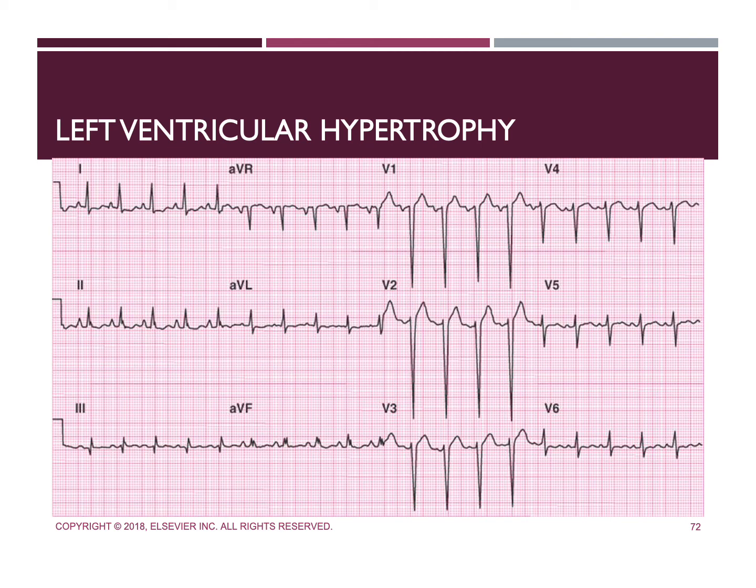To use this formula, we add the S wave amplitude in lead V3 and the R wave amplitude in lead aVL. A total greater than 20 millimeters or 2 mV in women, and 28 millimeters or more or 2.8 mV in men, suggests that LVH is present. That's the main formula that we use in determining LVH.